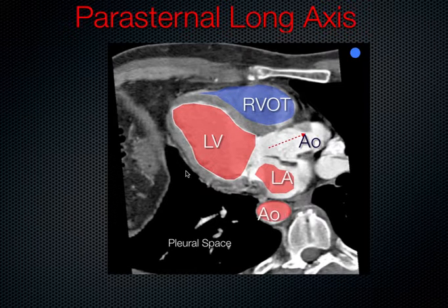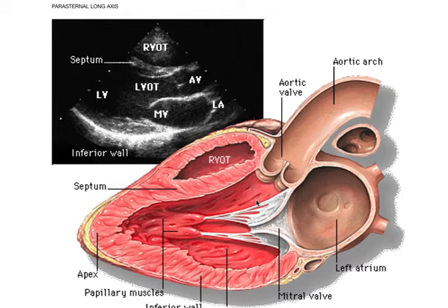And it's right up against the pleural space. In fact, the pericardium is what surrounds the heart, and the pericardium and the pleura are right up against each other right here. That reflection is coming along right here. And this is what it looks like. Just another schematic of this.